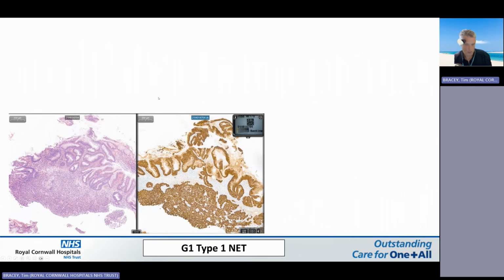I'm making this company sound really bad, but I think one of my local colleagues has made this misdiagnosis before as well. It's possible in a grossly inflamed biopsy to be looking at and obsessing about this inflamed area and thinking, I better do a cytokeratin and make sure it's not carcinoma. And of course you do the cytokeratin and you see this slightly infiltrative looking proliferation in that area, and then you call it carcinoma.